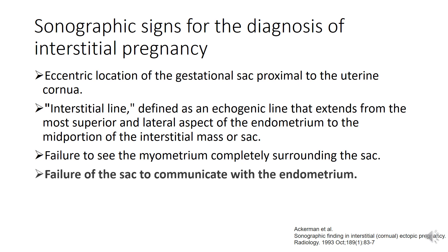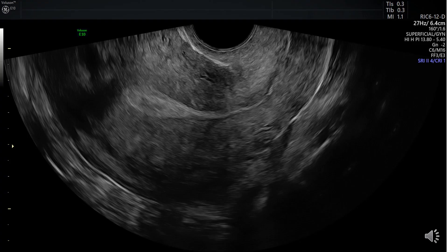The last feature is the failure of the sac to communicate with the endometrium. Here, we can appreciate again the distinct separation of the endometrium from the pregnancy, indicating that this is an ectopic interstitial pregnancy.